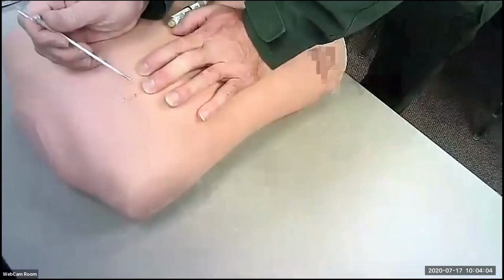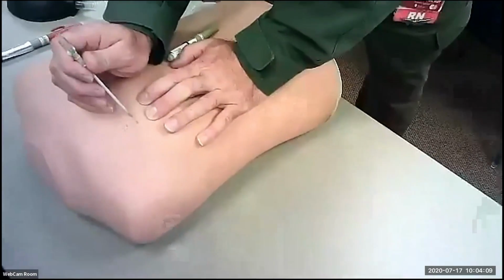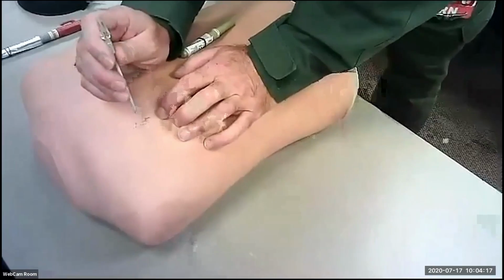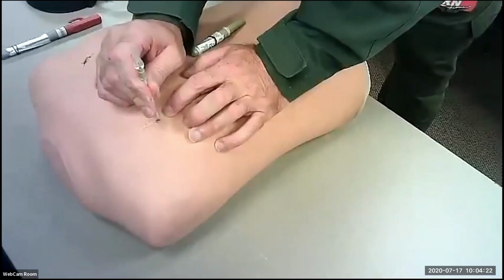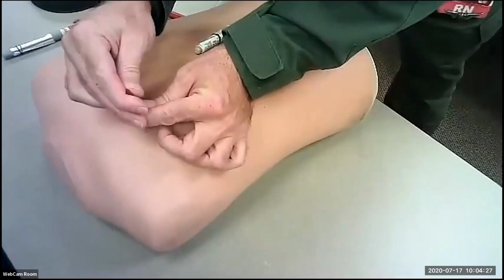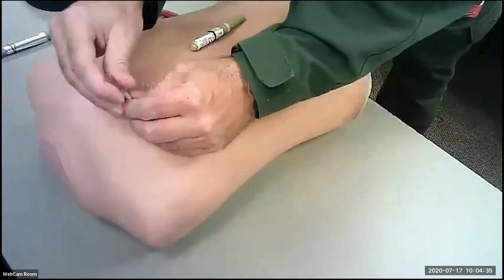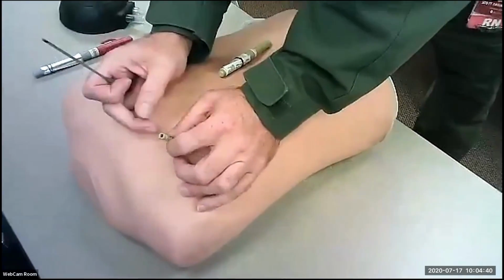What I want you to remember is when you needle the chest, you're actually going to the third rib, okay? Above that rib is the second intercostal space. You're going to the third rib. I'm feeling that rib, and I'm inserting this needle directly onto that rib, okay? So I'm touching that rib, and I'm going to slide it off and up and then in, okay? And you're going to pull the needle out. So all the way up, out, and slide all the way in. The video you're going to see in a second will demo that.